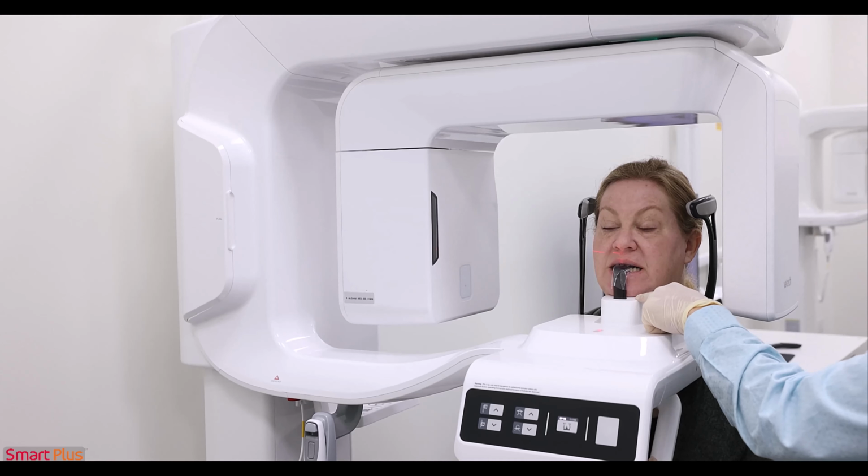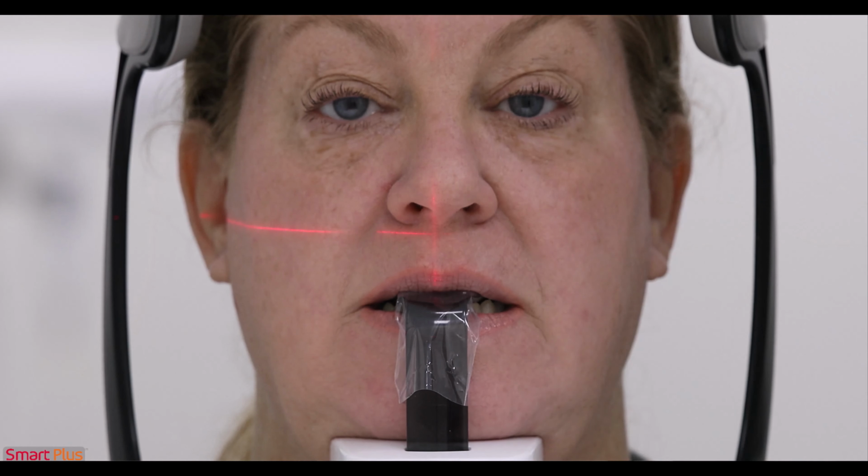So the next thing I want to do is I want to ensure that the patient is lined up center using our mid-sagittal beam.